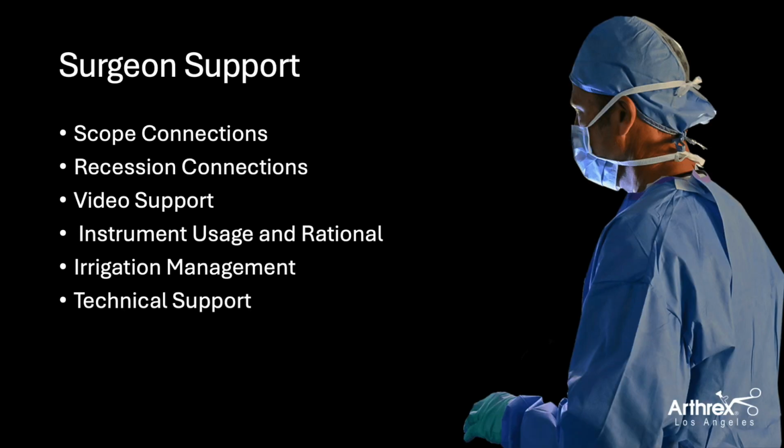In the spine endoscopy case, we want to make sure we also support the surgeon specifically, not necessarily as technically as we'll get into later in another video module, but it's important that we support the surgeon in knowing how to connect the scope, the light cords, and the drill, and also to make adjustments in the case. I think it's important that we know the settings within the case, from recording options from 5 minutes typically with arthroscopy now to an hour.